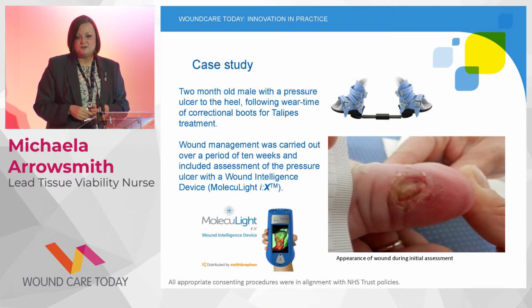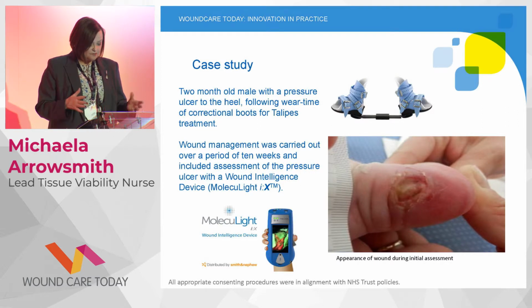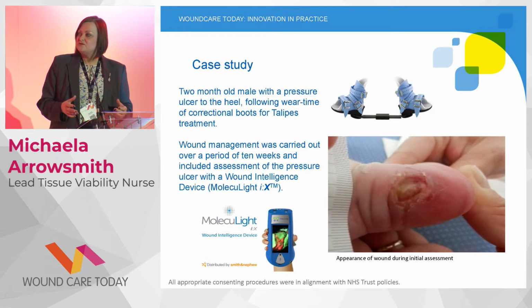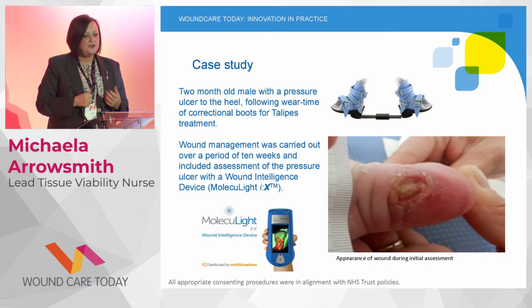He was born with talipes, and he's undergoing a long period of time with the correctional boots that they have to wear. So he was a long time in these boots, and you can see from the picture what the boots look like. Trying to keep a young baby still for 5 minutes is very difficult anyway.